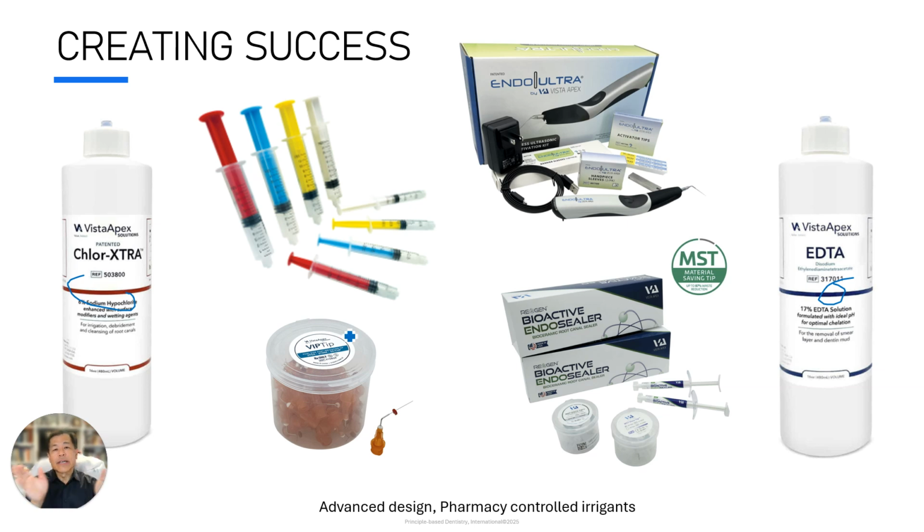Why? Because it's a dual side port syringe. It can't go out the apex area of the tooth, the apical portion of the tooth. And I will tell you, today when I was irrigating doing the root canal, I could use 20 milliliters of irrigant, and my hand could easily express the irrigant through the VIP tips.